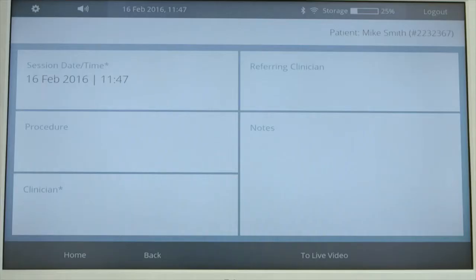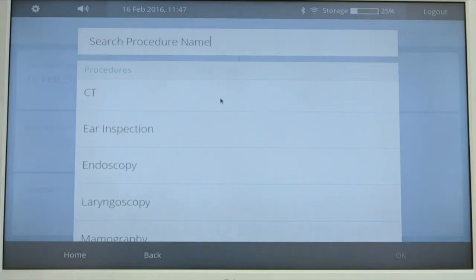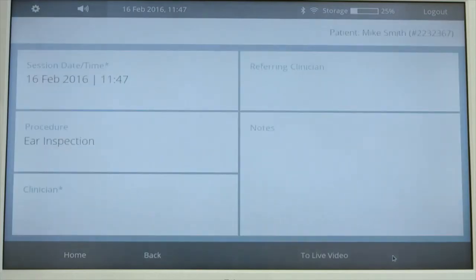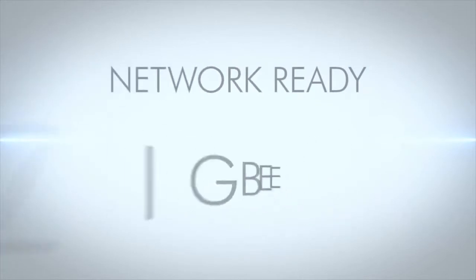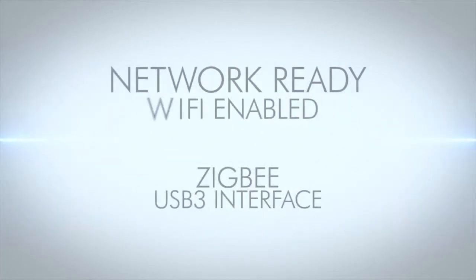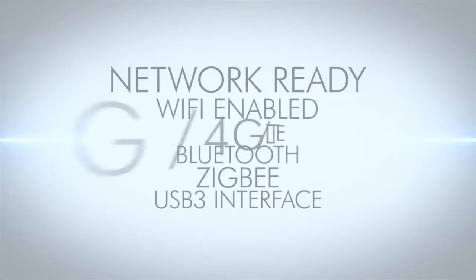Images and data along with patient notes can be reviewed at any time or shared with the local EMR software. The Pro-EX can also be connected to a network for image sharing between multiple Pro-EX units and PC workstations through a medical practice.